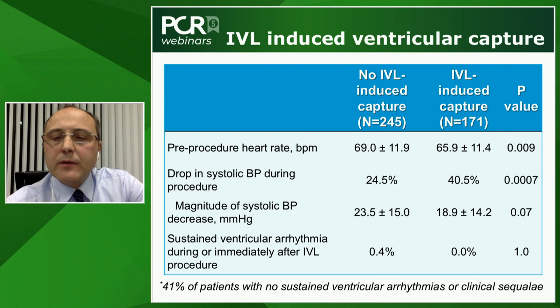Michael, let me further extend this discussion on possible issues, concerns or drawbacks of this current iteration of the device. Do you have any point, any comment to add here before taking additional questions from the colleagues? Yeah, I think one point is important to understand: the catheter, the balloon, is not really a dilatation balloon. It's an application balloon. So you see, we just want to open it to 4 atmospheres, maximally 6 atmospheres. This is not a range we are usually working in in calcified lesions. So that is what we need to understand.